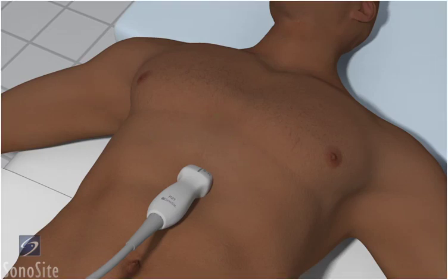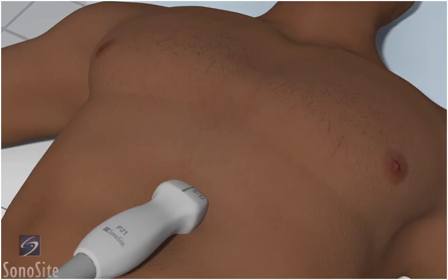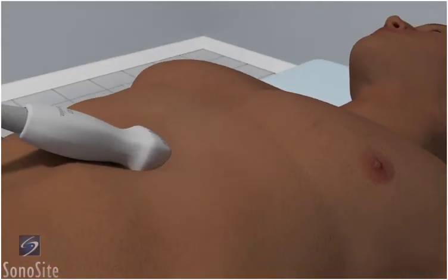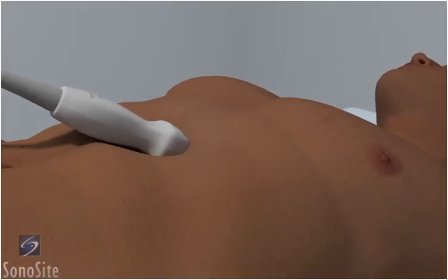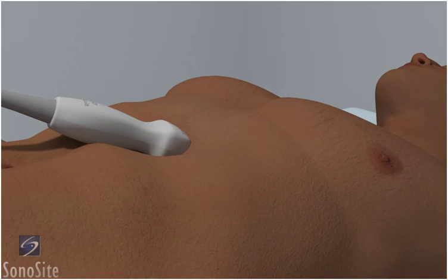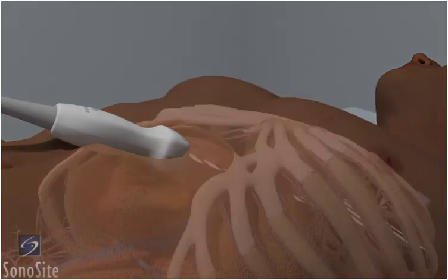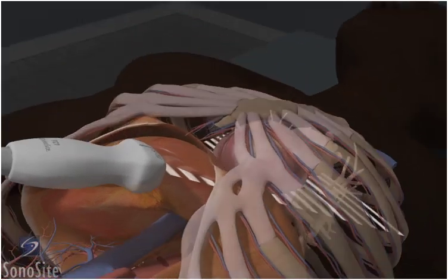This view uses the liver as an acoustic window to visualize the four chambers of the heart. Aim the transducer slightly toward the left shoulder at a 15-degree angle to the chest wall. In some cases, the transducer is almost flat to the abdominal wall, so the ultrasound beam is directed toward the left chest cavity. A considerable amount of ultrasound gel and downward pressure may be needed to maintain contact of the transducer face with the abdominal wall.